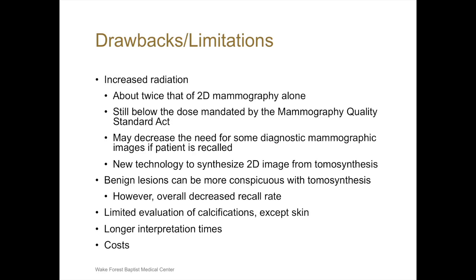Also, although we're increasing the radiation initially, if a patient is recalled, we may not have to do as many mammographic views to work up the patient. And there's a new technology that can synthesize 2D images from 3D images. As that grows, we will not have that downside of increased radiation with 3D tomosynthesis.